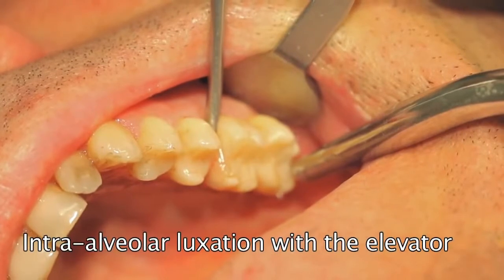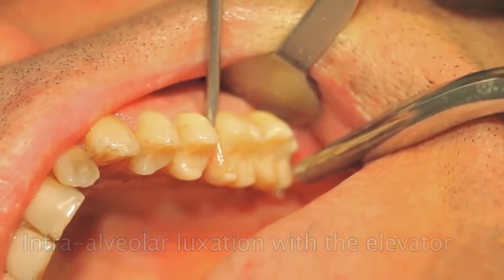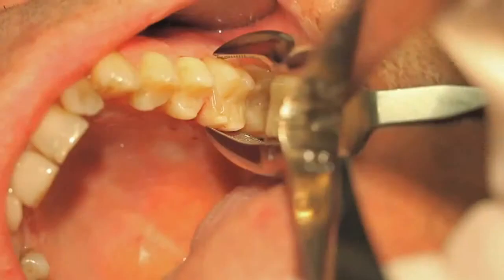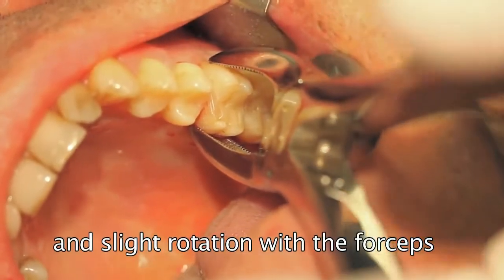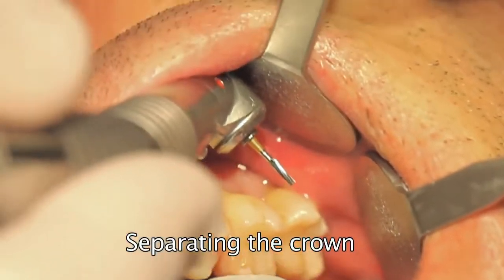Luxation in a disto-mesial direction ensures that there is absolutely no force on the buccal wall. Slight rotation with the forceps will additionally loosen the periodontal fibers. The crown is then separated and removed.